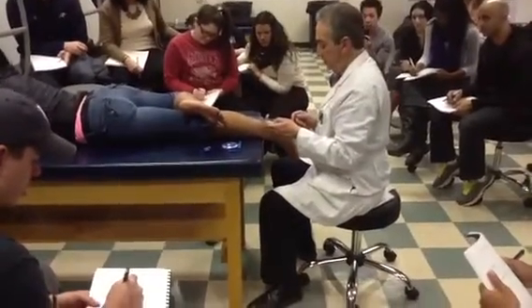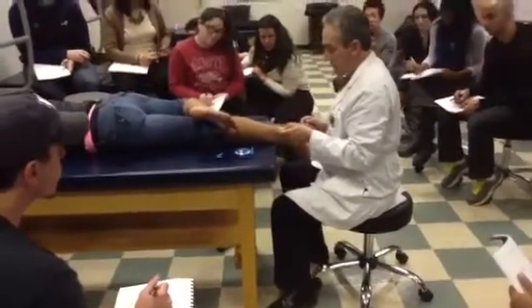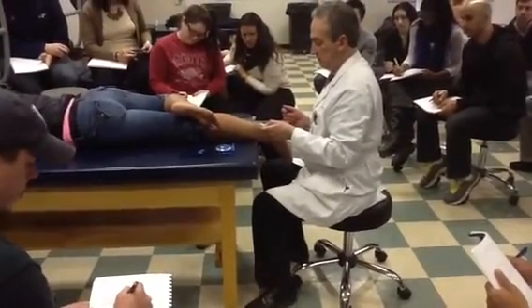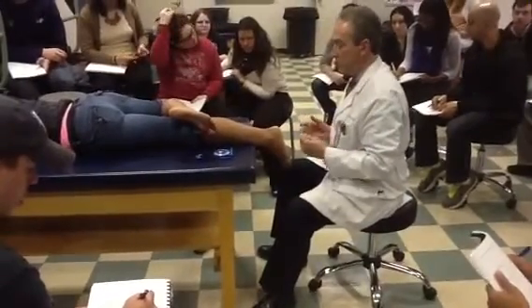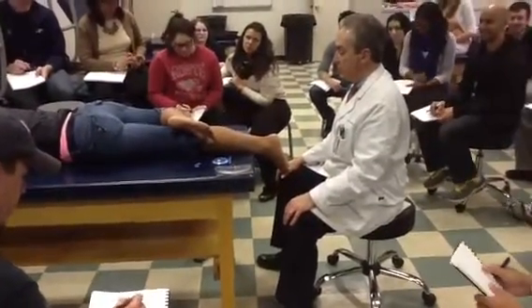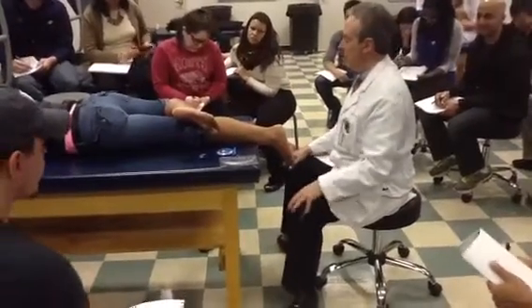Okay? Find your pivot point, line up one line bisecting the calcaneus, other line bisecting the leg, piece of cake. Okay? Subtalar joint range of motion, very simple. Also, while I have the patient prone, I'm going to show you how to do forefoot to rear foot measurement. Okay, and I'll try and show you the simplest way to do it.